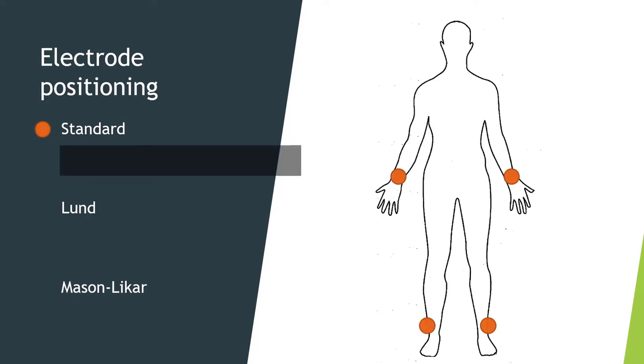The first of them is known as the standard. So this is what was first developed for doing 12-lead monitoring, and it's what most 12-lead machines are calibrated to work with in terms of their own interpretation methodology. But a long story short, the electrodes are placed on the wrists and the ankles, and the 2 sides need to mirror each other, an equidistant rule, if you like.